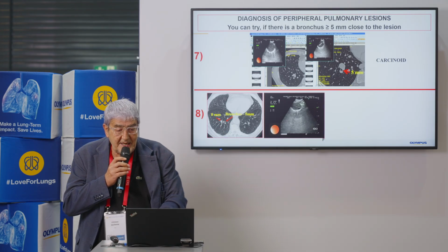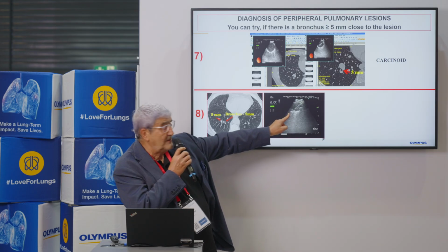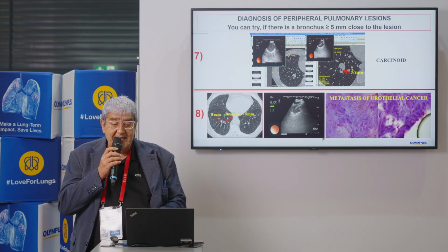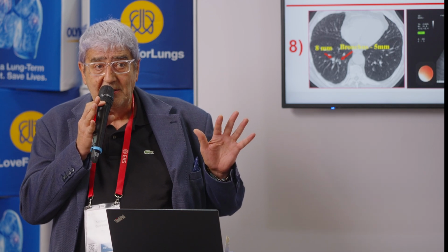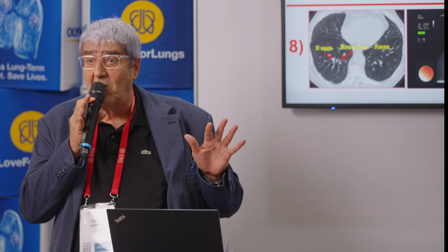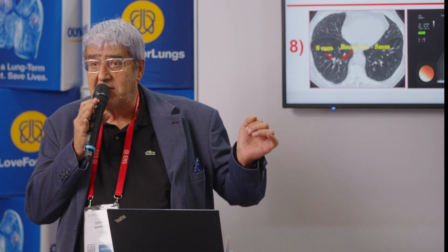And it's very easy to take a biopsy. Look at, this is the needle. And the diagnosis was metastasis of urothelial cancer. 10 minutes of procedure. No need of fluoroscopy, no need of robotic bronchoscopy, no need of further technology. Just EBUS-TBNA.